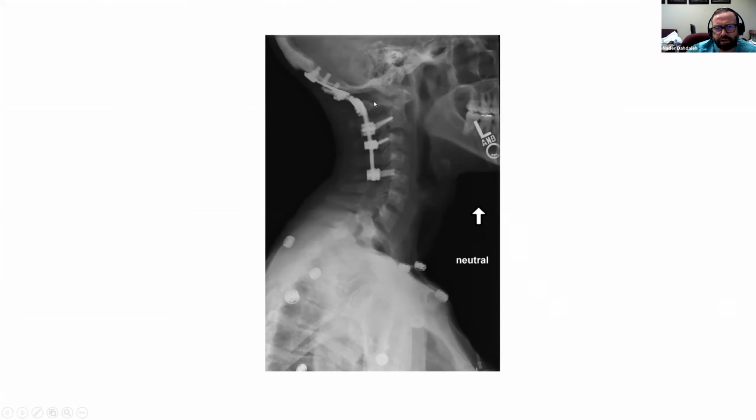And then because I also want to put bone graft as much as I can in that gap, I skip it, but certainly you can include it, either or. I would definitely have a low threshold to go to the occiput. It's highly unstable. Bone quality is not good, so you want good fixation, multiple points of fixation above with the occiput and then below with those screws, C2 and then the subaxial screws.